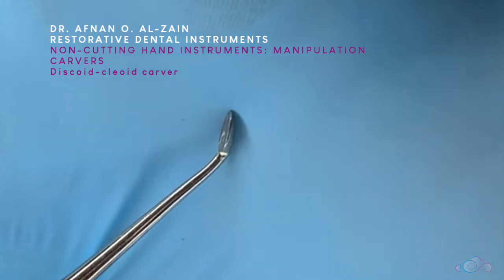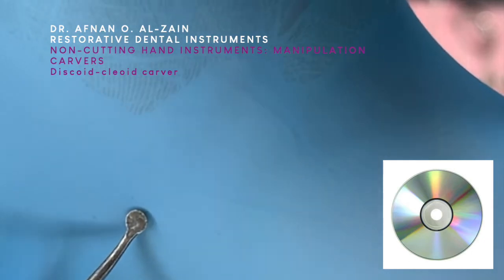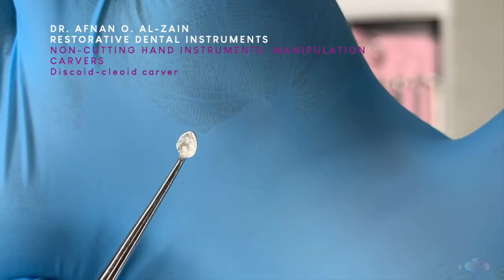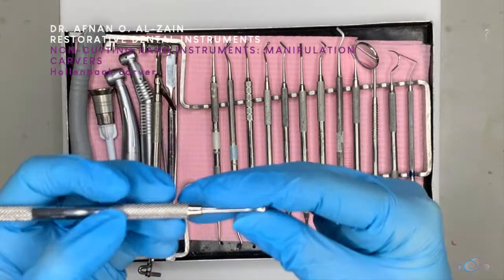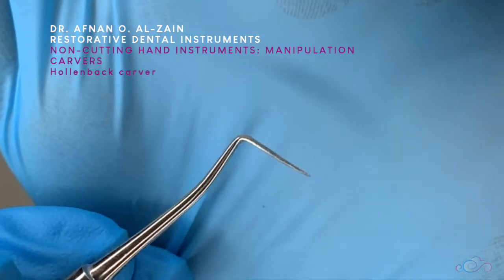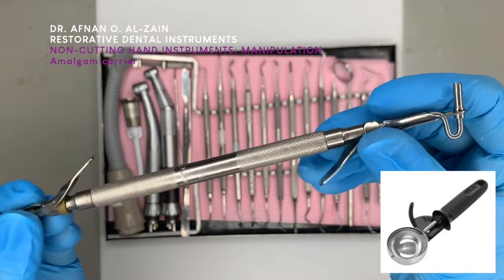Here we have the carving instruments. This is the discoid-cleoid carver — this is the cleoid part and the other side is the discoid part. It's called discoid because it looks like a disc, and '-oid' means similar to. This instrument is used to carve amalgam restorations. This is another carver called the Hollenbach carver, also double-ended and used to carve amalgam. This is an amalgam carrier, used to carry amalgam — as the name suggests.